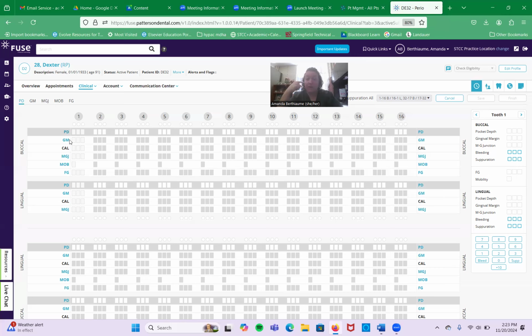But we want to mark or measure those because if they start to increase, we say, hey, what's going on? What's the underlying cause? Why is this happening right now? And it means that there is support of the tooth disappearing.